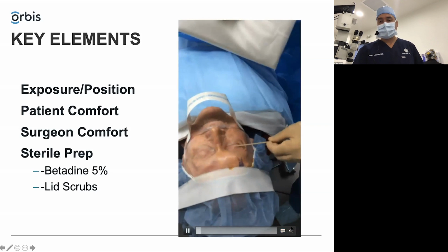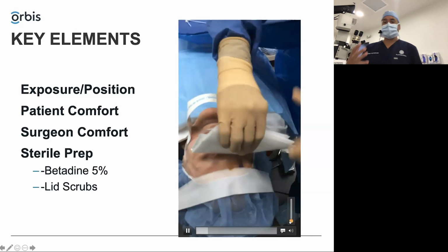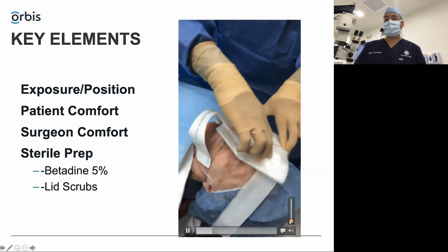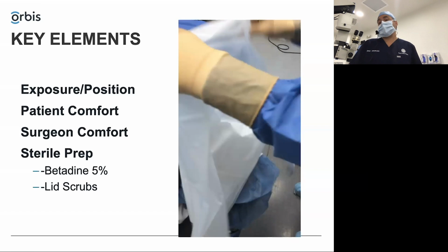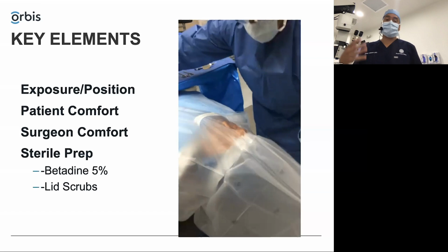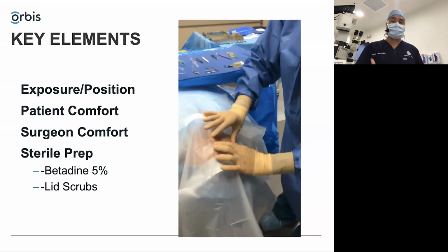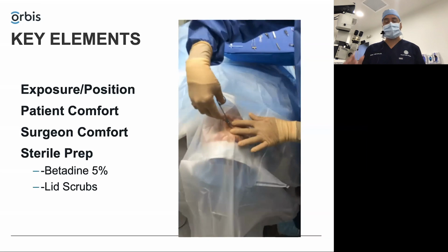I'll turn the volume down. So you're seeing the video here. But basically, the patient has to be comfortable and the surgeon has to be comfortable. If they can do it without any IV sedation or just with a Valium, every country is different with that. If you do it with a block, do it with a block. If you can do it comfortably with topical, do it with that. But you need to find a comfort zone for you and for the patient.